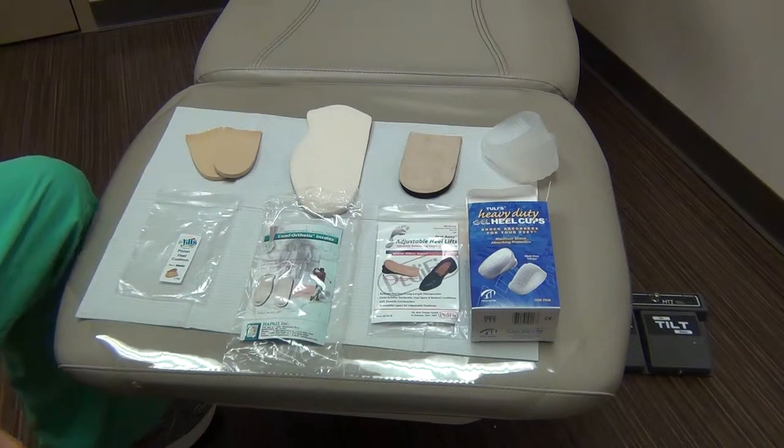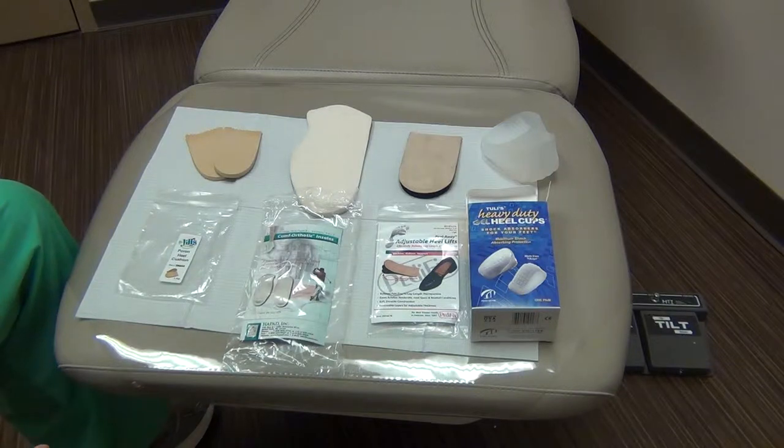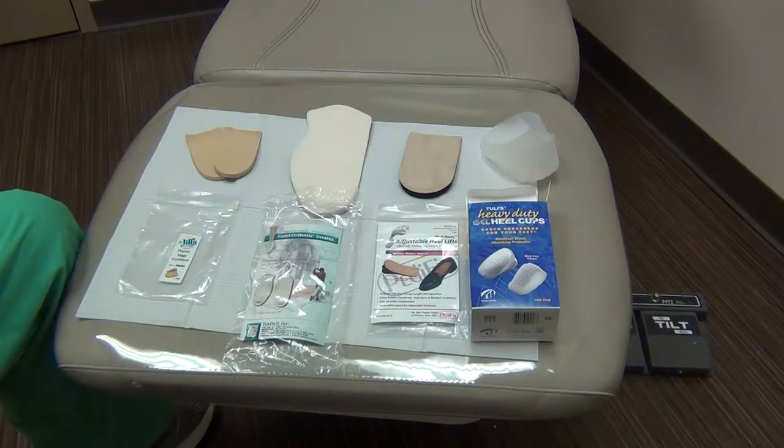In this video we'll be discussing the different types of padding that we have available here at FANT for patients that are suffering from heel pain.